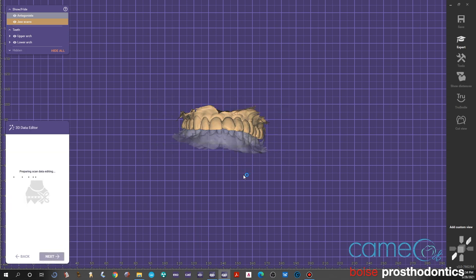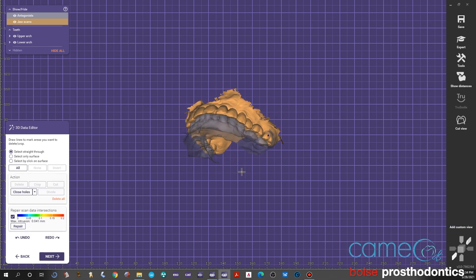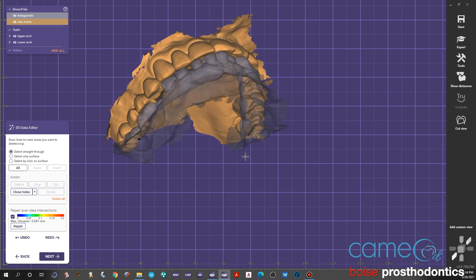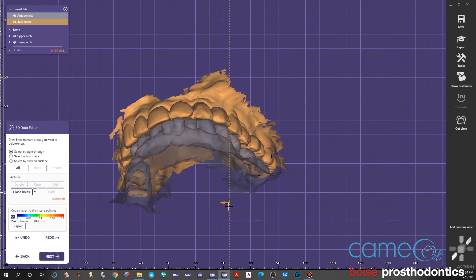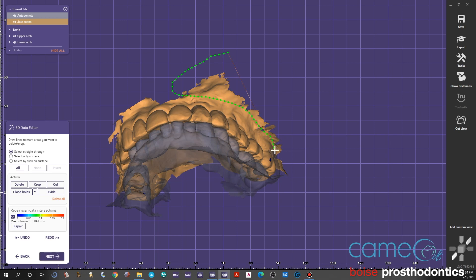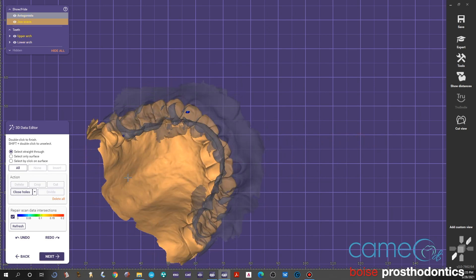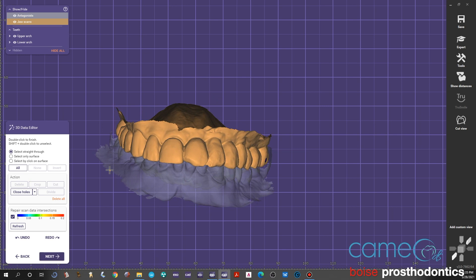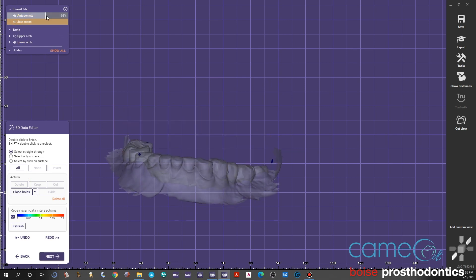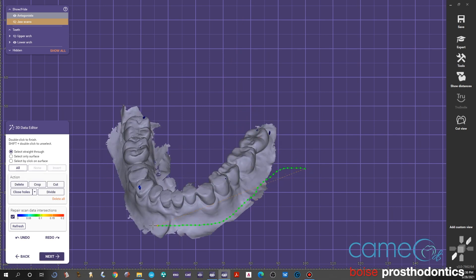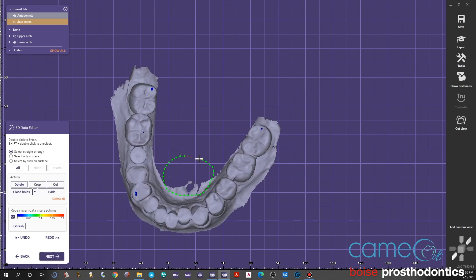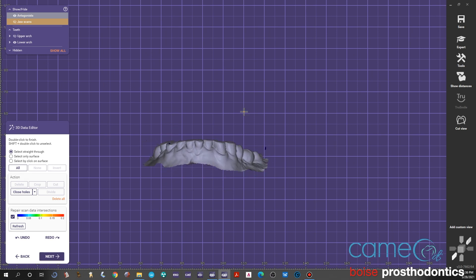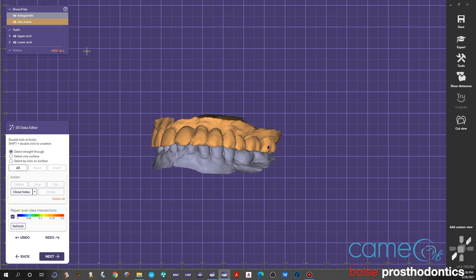Move on to next. In this step you can edit any of the scan data, like that little area out there above the maxillary anterior teeth that looks like a lot of extra data. You can actually highlight it and trim it away. If you need extra data that you'd want, you can actually circle it—it'll highlight and you can click delete and now it's gone. That back left area, same thing—all those little areas you can click on and delete. In this one as well, you see that little fin in that posterior left area, you can trim it. It's just a nice, more clean, neat model when you print it. It makes it easier to create those models if you don't need that vestibular depth in any form.